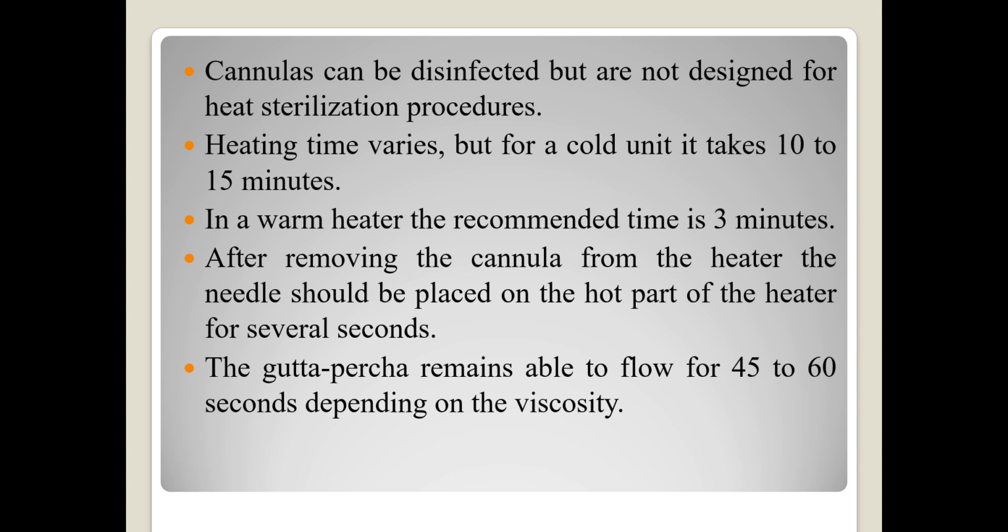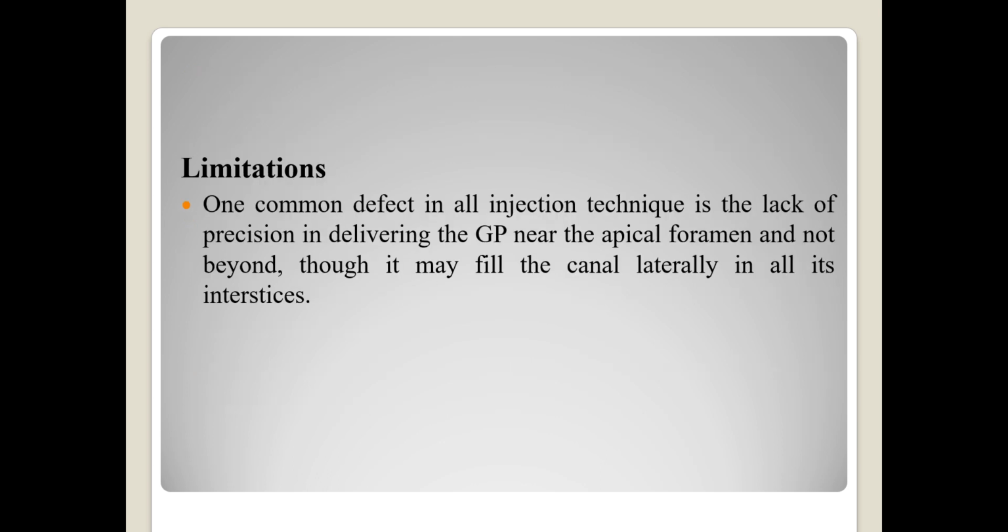Heating time varies, but for a cold heater it takes about 10 to 15 minutes. In a warm heater, the recommended time is 3 minutes. After removal of the cannula from the heater, the needle should be placed on a hot part of the heater for several seconds. The gutta-percha remains able to flow for 45 to 60 seconds, depending on the viscosity.